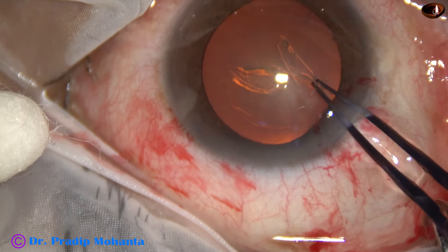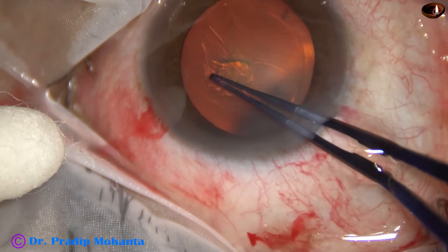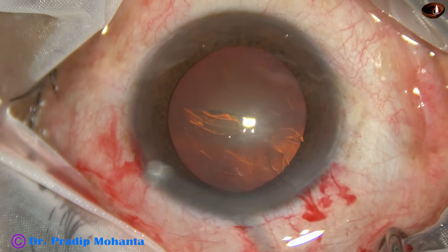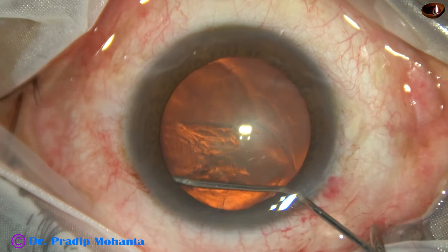I usually go anti-clockwise with my right hand and clockwise with my left hand. Sometimes I do phacosurgery with my left hand. Hydrodissection is done.